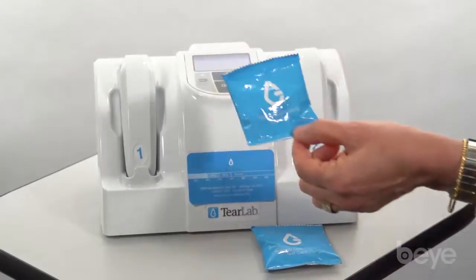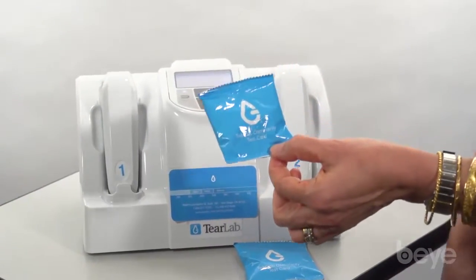And if one sees a trend of the numbers going down towards 300, then you know the treatment regimen is adequate and working. If you see the numbers going up, then either there's patient non-compliance for the treatment that you're recommending, they're not using their cyclosporine, they're not using their oral omega-3s or whatever it is that you have recommended, or their disease is still progressing and you need a more aggressive treatment. Therefore, having a concrete objective number helps with the treatment of ocular surface disease and meibomian gland dysfunction through tear osmolarity.